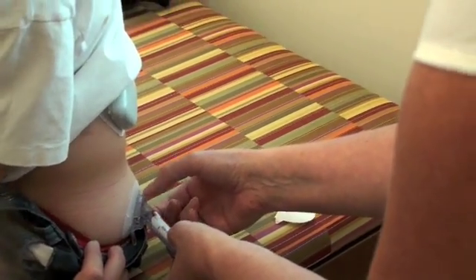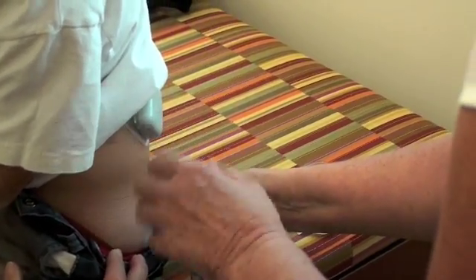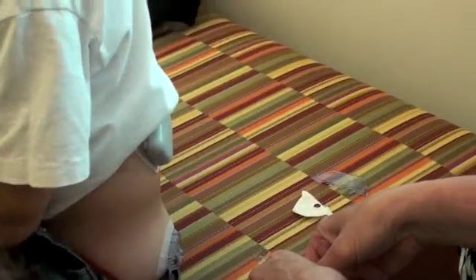Okay, so after you get it in, you squeeze these two parts — it's already in. The needle's out. It's already in. You okay? Squeeze and pop. We're all done. Oh, that's right, I forgot to change it.